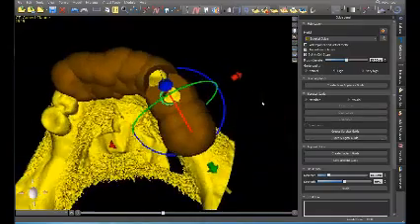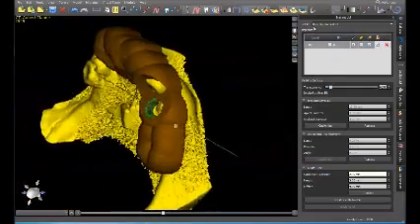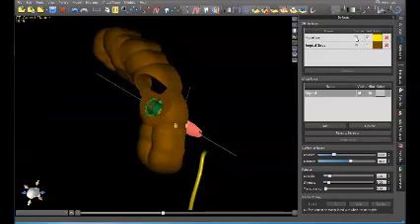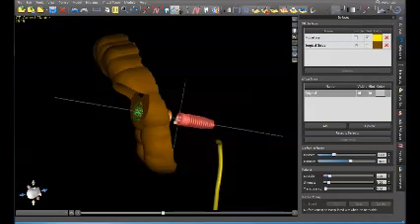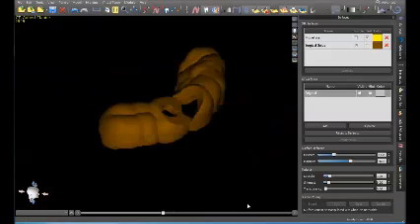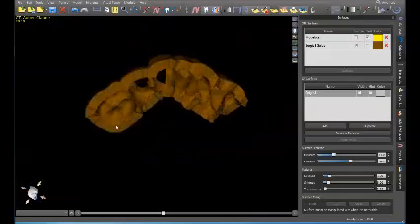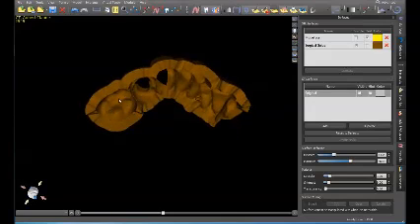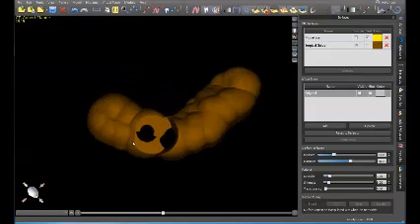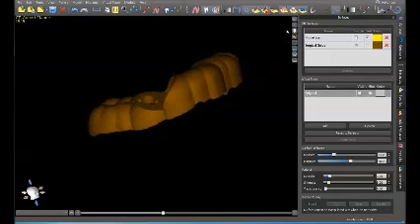And this is what you'll get when it's all said and done. Just make sure that our implants are on lock so we don't change the orientation at all. We'll turn surfaces off and turn all implants off, and you're left with something like this. So it'll be good because you can see this tooth. It has a distal tooth to rest on after the extraction. Now this is taking into consideration that we treatment plan this without extracting the tooth.